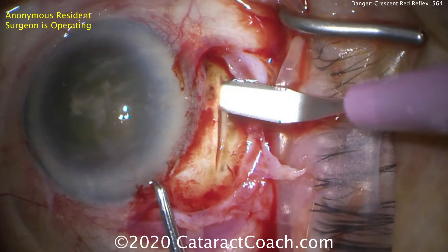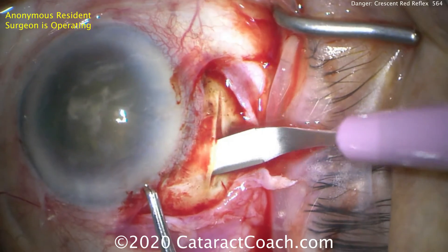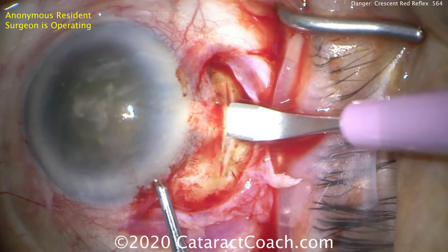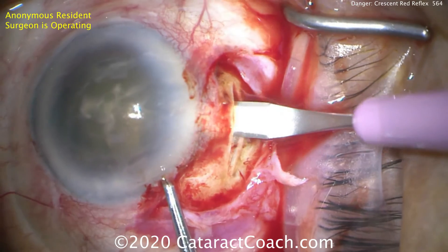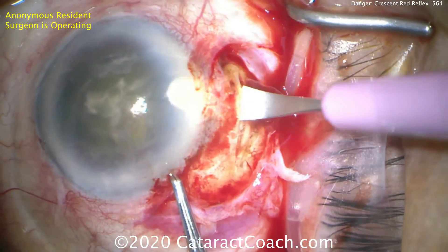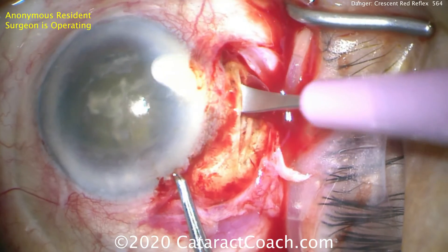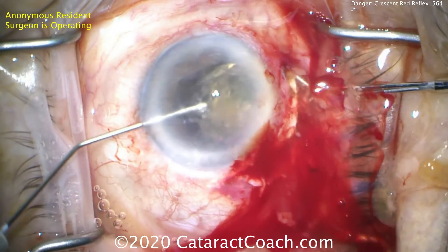If you missed it, you're going to be sunk. So now let's leave the nucleus as is and we're going to do a small incision cataract surgery technique — a manual extraction. Avoid enlarging the corneal incision; you don't want to do that. Here we're making a new scleral tunnel incision with a nice long shelf in a trapezoidal manner in the traditional SICS technique.